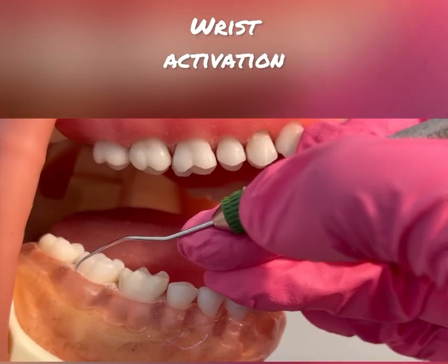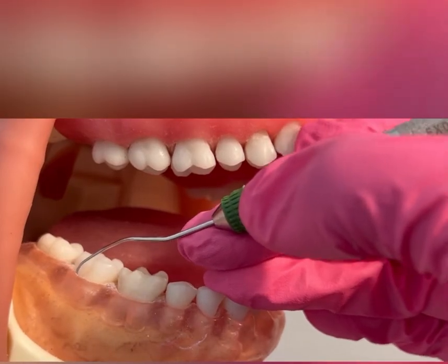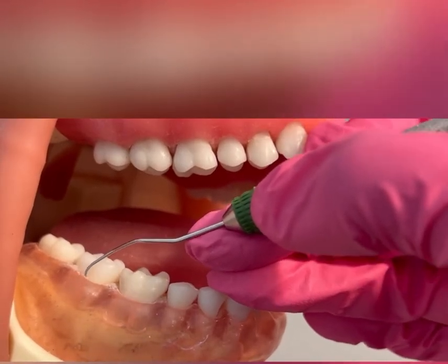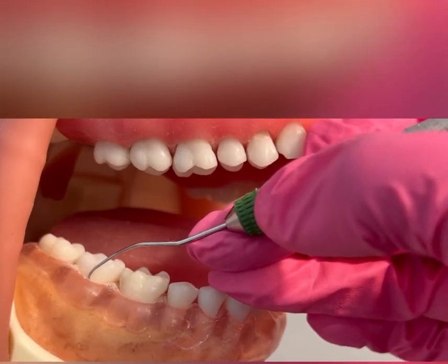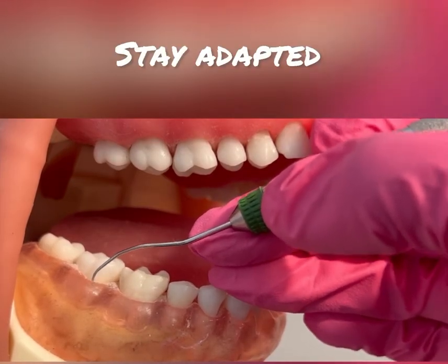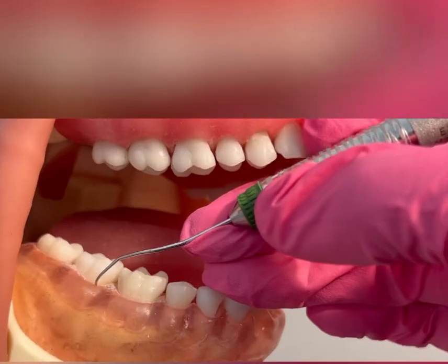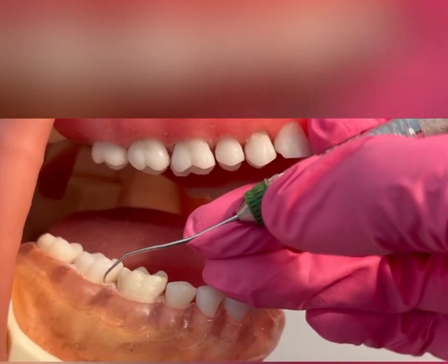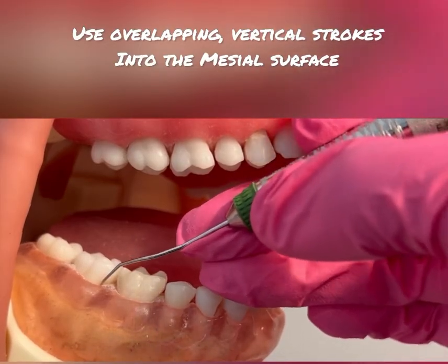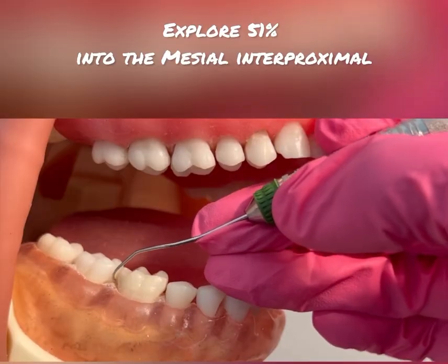I'm using wrist activation, maintaining my modified pen grasp and good ergonomics. I'm using my tactile sensitivity to feel the vibrations and detect any calculus, overlapping across the buccal. As I come into that mesial line angle, I'm going to start to roll the instrument handle between my index and thumb, staying adapted as I roll. You can slightly come up on your fulcrum here. As I roll into the mesial line angle, I'm using vertical strokes, with a feather-like grasp, working my way 51% — a little more than halfway — into that mesial interproximal.